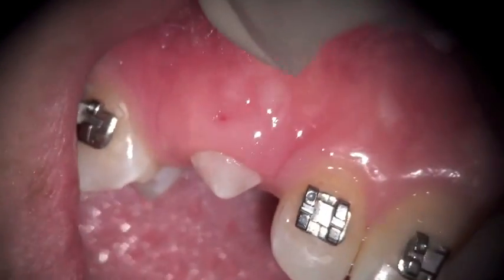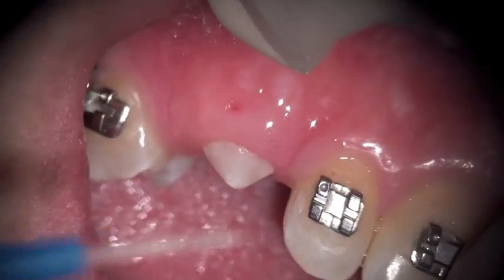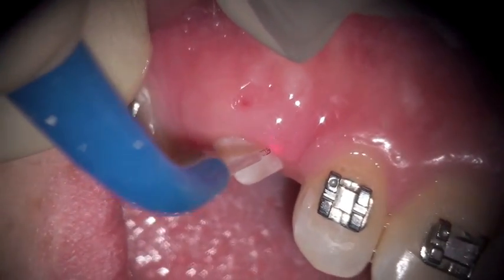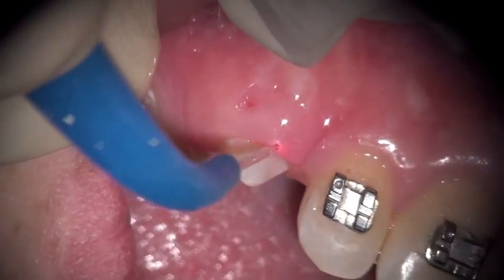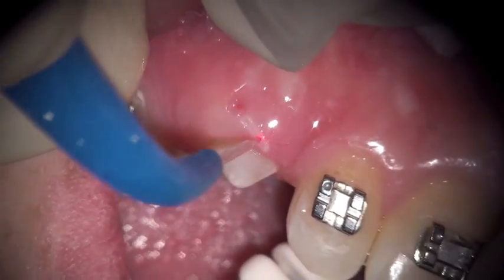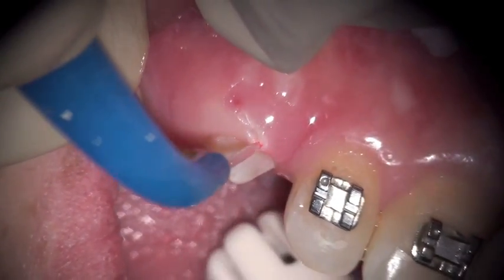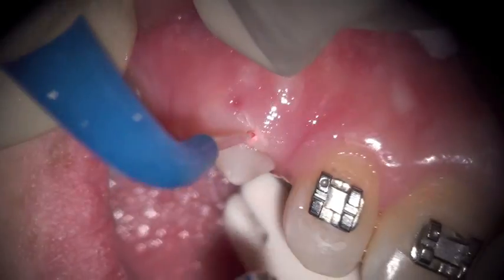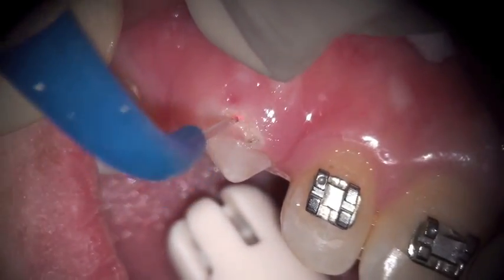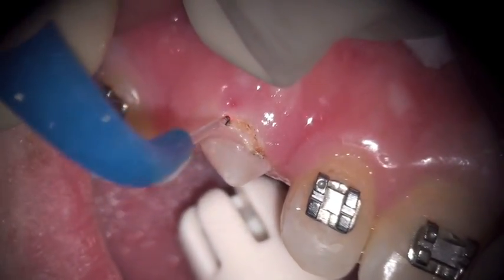What I'm going to do, I'm just going to use 1.4 watt pulse. Is it disposable? You ready? Yeah. Just blow some air on there once in a while. Now, if you want to use 1.5 watt pulse — okay, so this portion is going to be a bit easier.